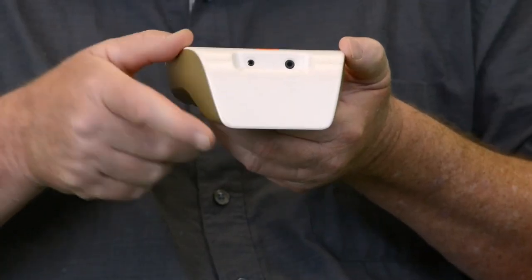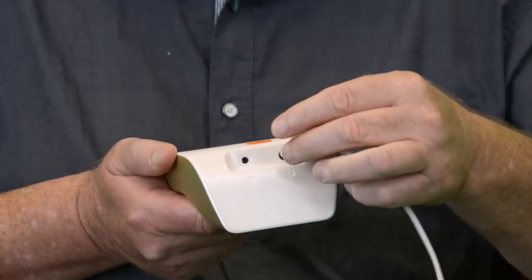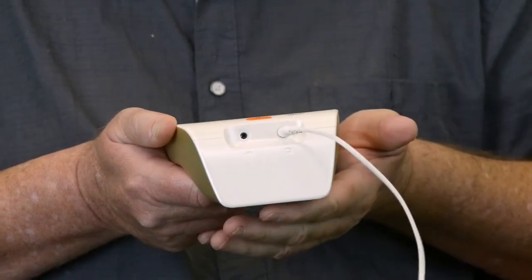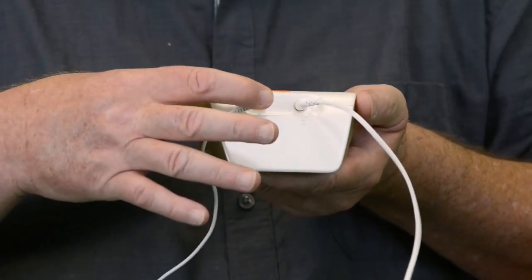Now that we have everything out of the box, I want to help you get set up for your first session. Each RESPeRATE machine is distinctly marked with a marking for your sensor belt and one for your earbuds. So you want to take the earbuds, place them in the jack, gently pushing until you hear it go click. The same with the sensor belt. You want to take the sensor belt pin, put it into the spot, gently push until it clicks.